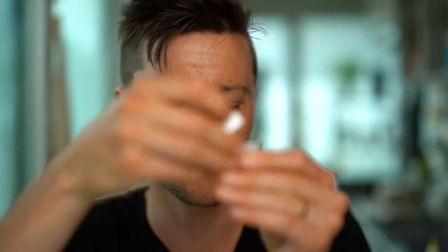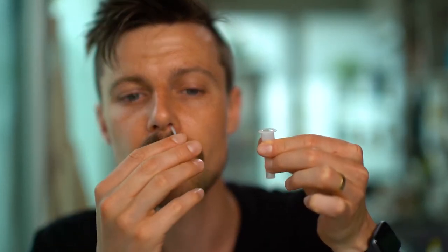Open this up — you probably can see. I just opened up this one. I've got the nozzle now. It's gonna go in right there in ten seconds.